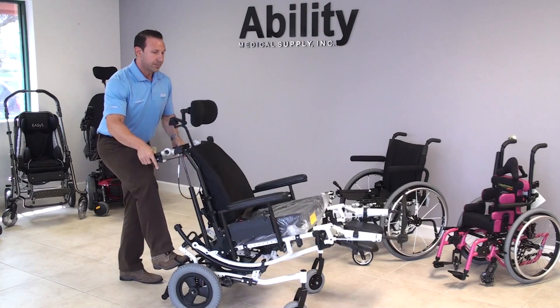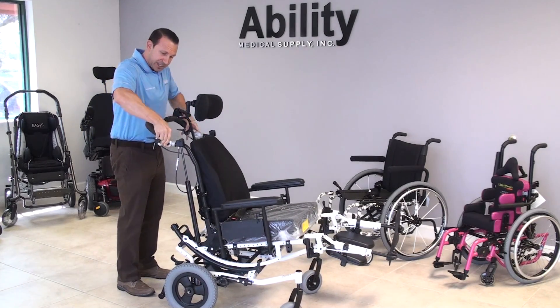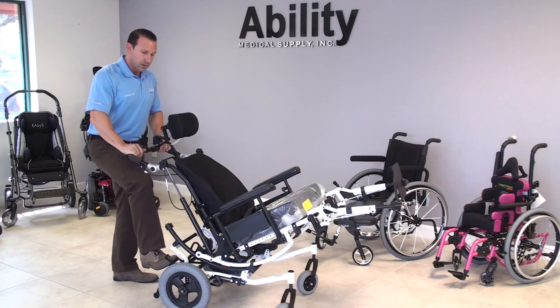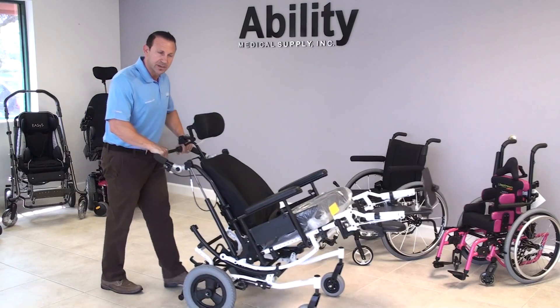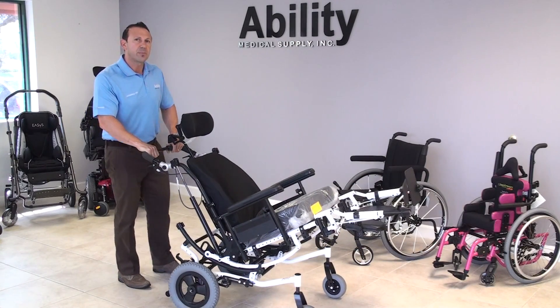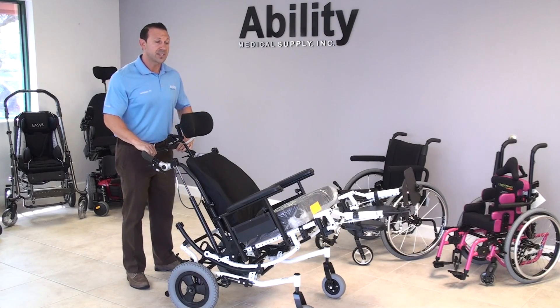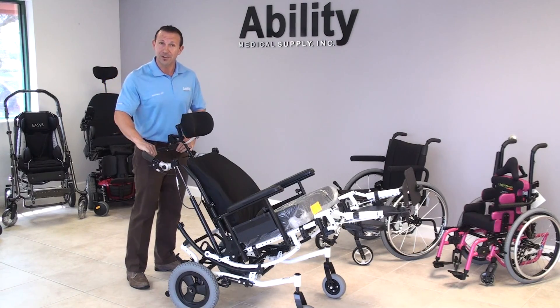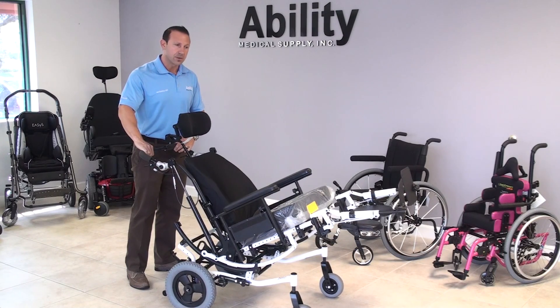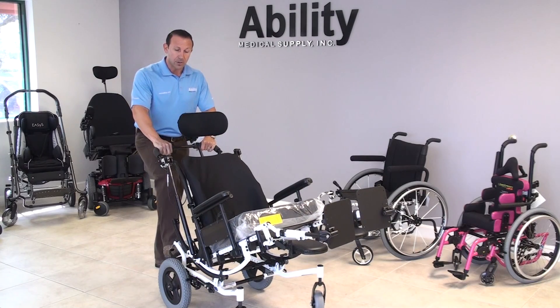Another great feature is the adjustable stroller handle in the rear, so we can change the angle of the stroller handle. While the chair is tilted, we're still able to push it very easily. This chair was designed with as much the patient in mind as the caregiver. I've never seen a dissatisfied patient or caregiver that have used this type of system — very successful, with really good experiences with this chair.